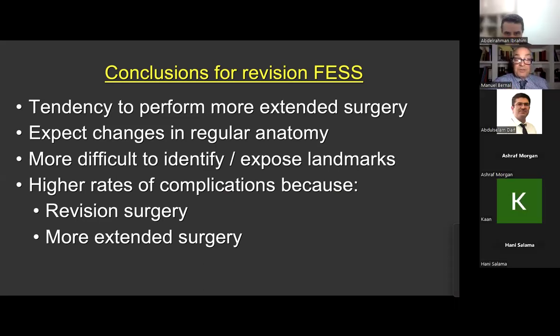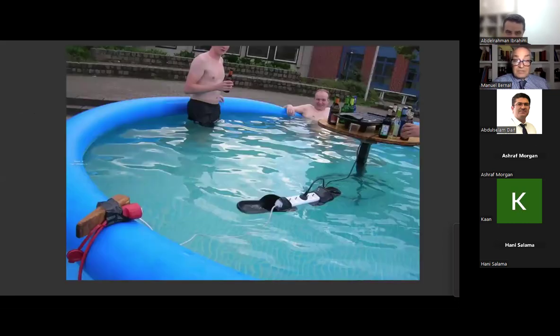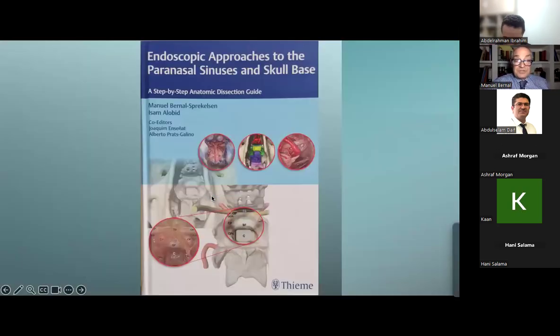It is preferable to have a remnant cell or a remnant polyp somewhere in the corner than to end up with major complications. Otherwise, you are putting yourself at risk. Seriously, try to avoid this. And should you have further questions, I will be pleased to answer them.